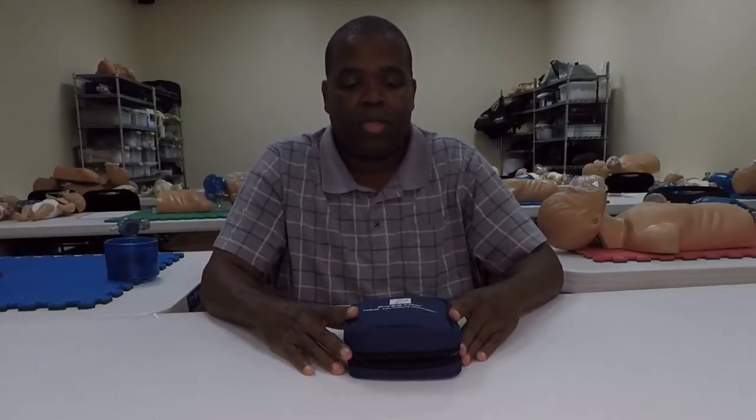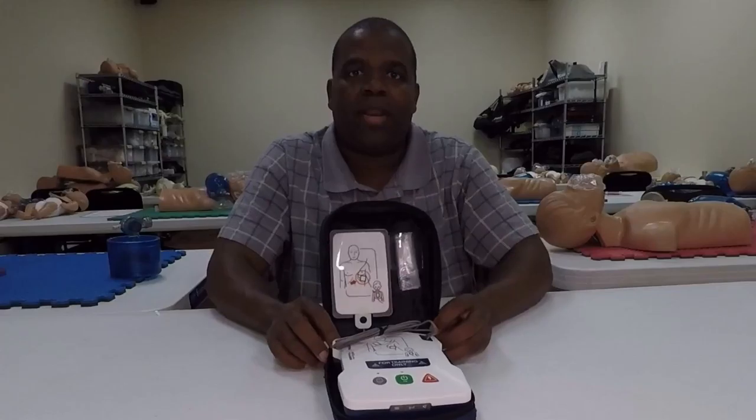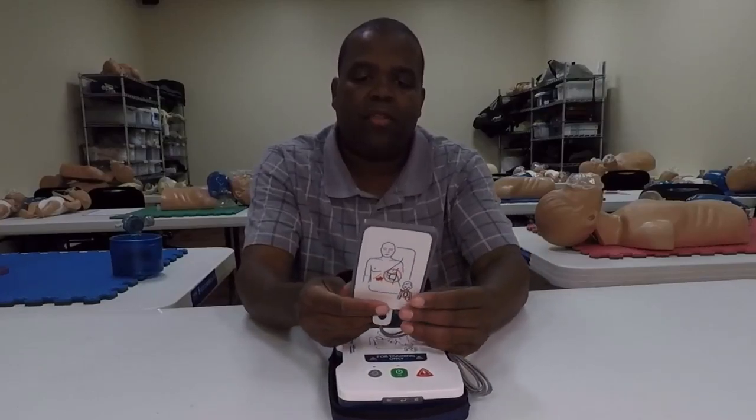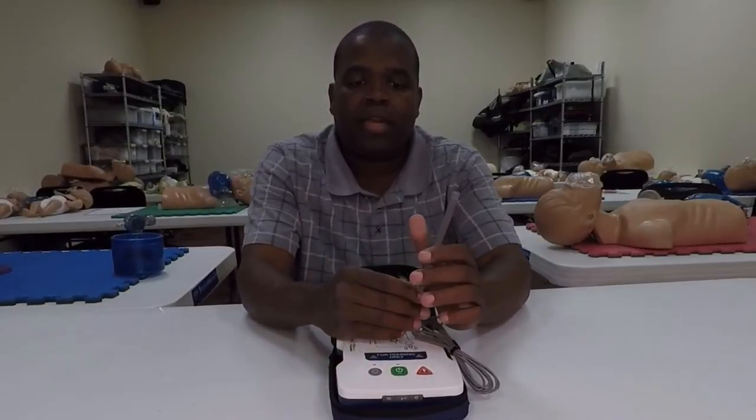First thing I like is the little case — it's small, it's simple. If I want to take a couple of these, I can just load them up; they're lightweight. When you pop the case open, everything is already in there. It's its own little carrying case. The pads, just like the other Prestan AED trainer, are on the actual card.